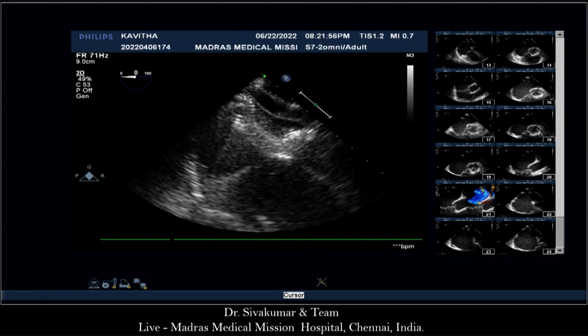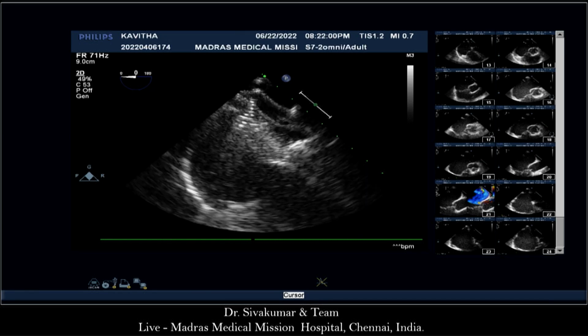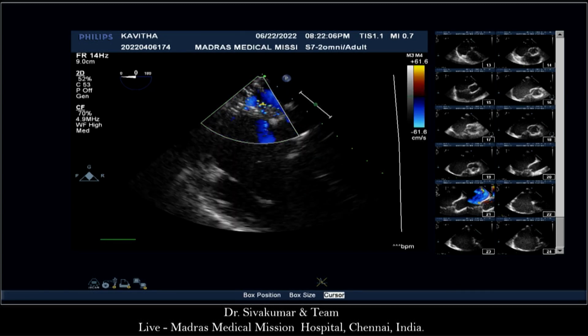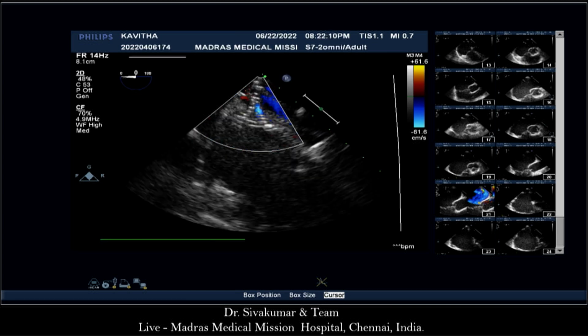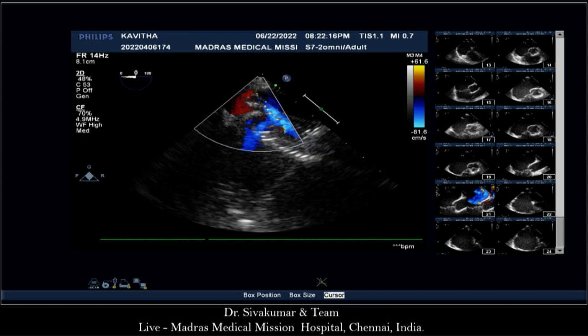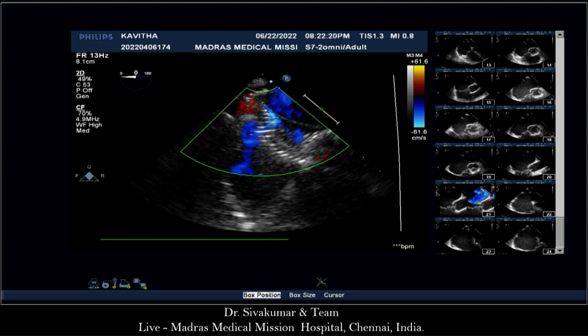Yeah. The left atrial device has formed well on the superior aspect. Yes. Posterior rim is there. Color the posterior margin. Make the colors very small. Zahid, this was the thing that I mentioned. The posterior margin was smaller. Okay, now rightward rotate and get the posterior margin in the center. Perfect. Now keep going inside progressively.